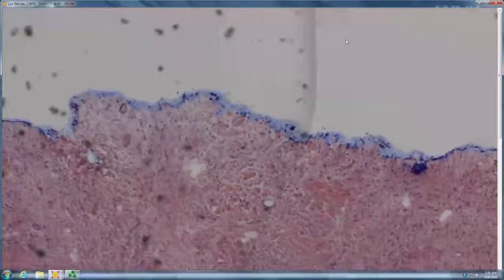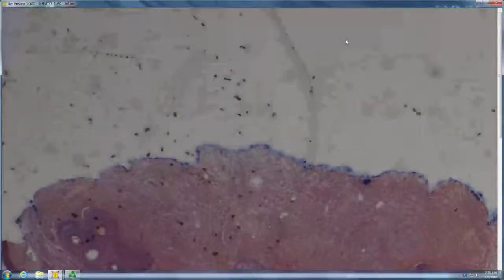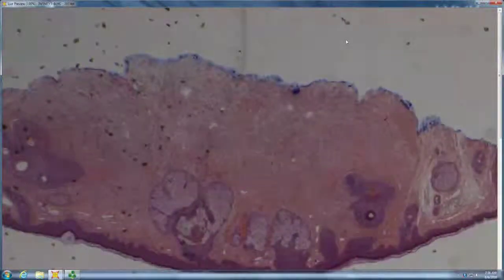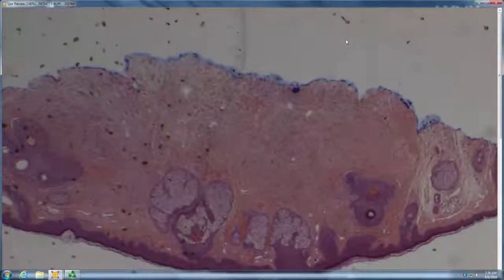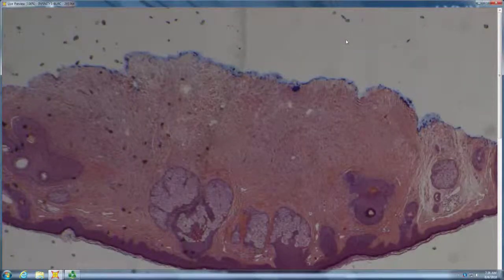So this is a variant of follicular sebaceous cystic hamartoma, and the stroma can kind of resemble neurofibroma. Then they're called neurofollicular hamartoma, but it's not S100 positive. There's nothing neuro about it. It is the same kind of stroma that's around all pilar tumors. It's CD34 positive, just like normal follicular sheath.